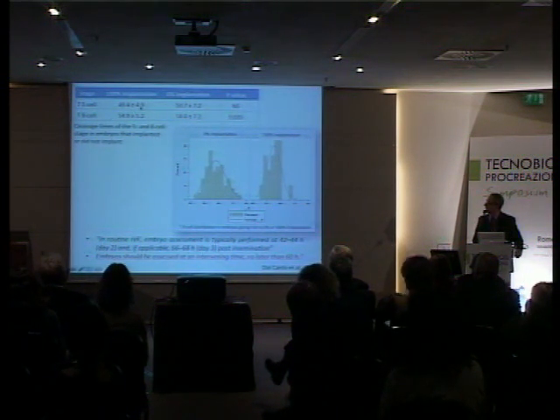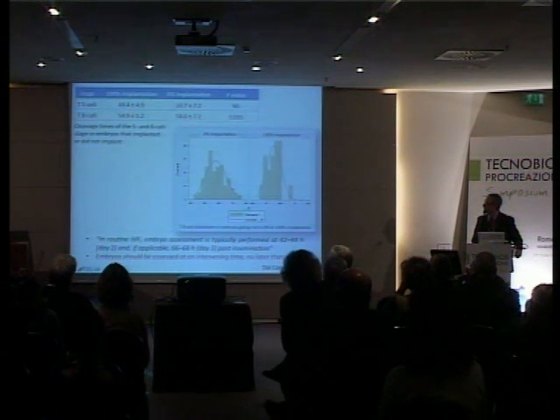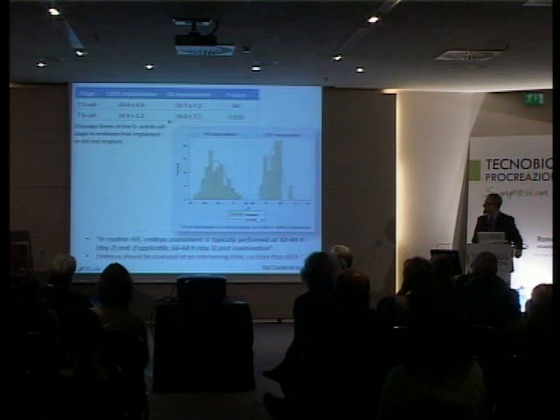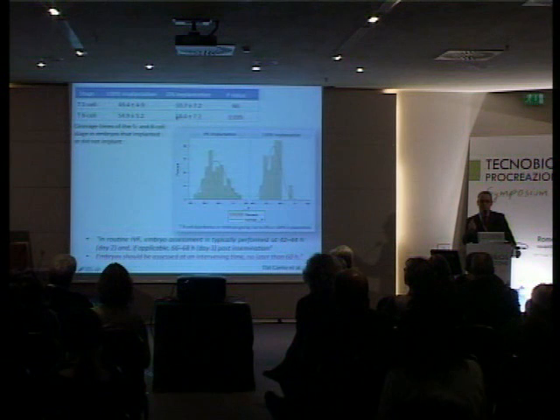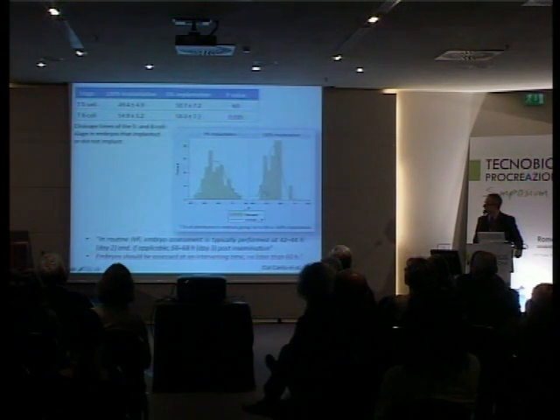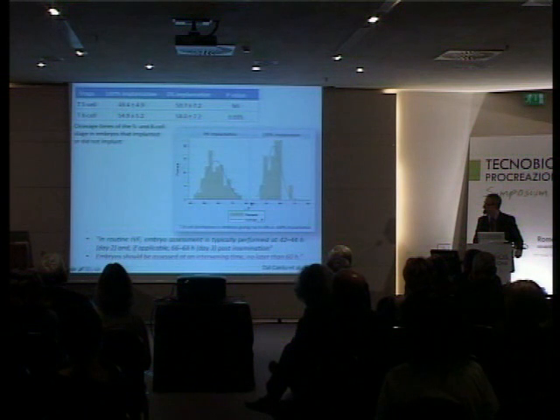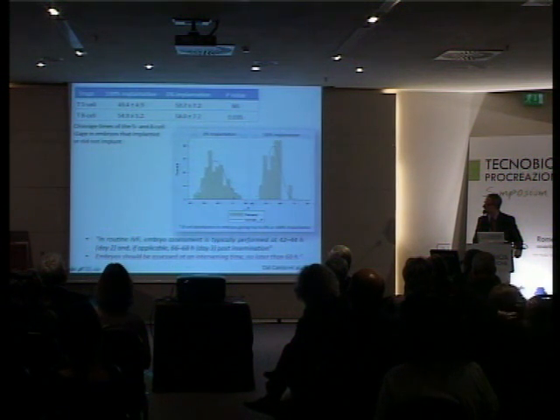And as you can see here, until the 5-cell stage, there is no detectable statistical significance among the 2 groups, but a difference emerges afterwards at the 8-cell stage. So although these are simple individual parameters that would not be able to totally predict implantation, it is relevant to this ability. It is also interesting to note here the distribution times of the 2 groups. Here is more scattered, if you wish, in the 0% implantation. There is more clustering in the 100% implantation.